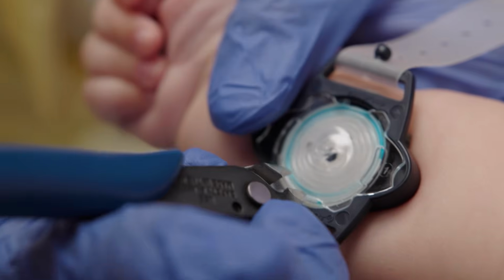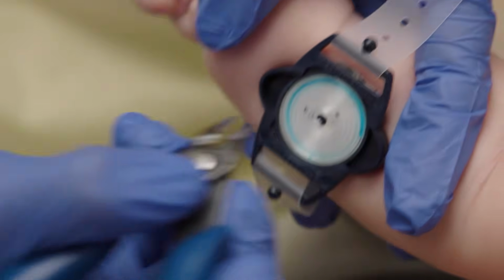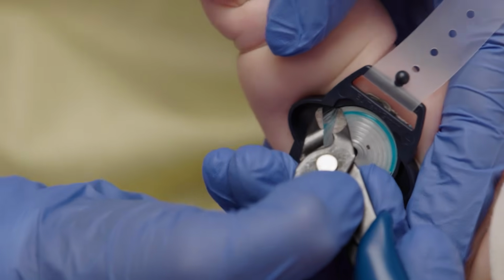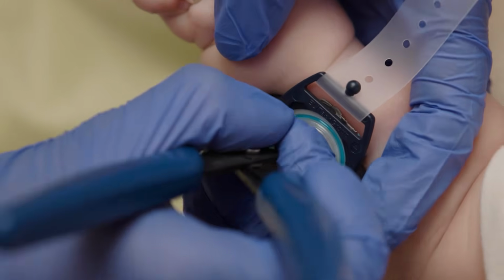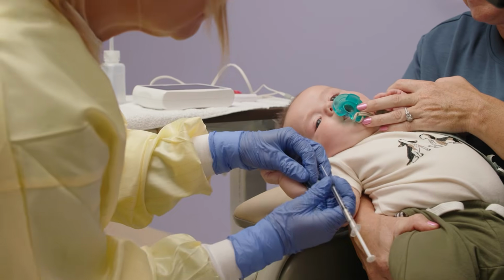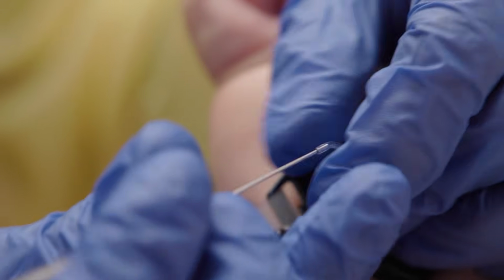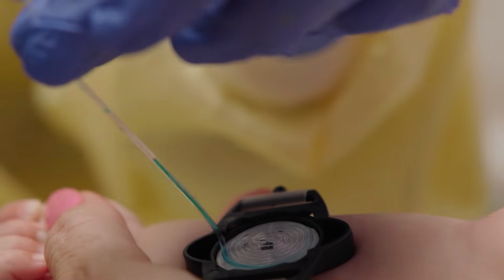To start the sweat transfer process, begin by removing the cover using the nippers, and using the nippers, lift the end of the coil and gently lift upwards to uncoil. Once the coil is unwound a few centimeters, insert the syringe needle 2 to 3 millimeters into the end of the coil. Continue lifting the coil until it's fully unwound.